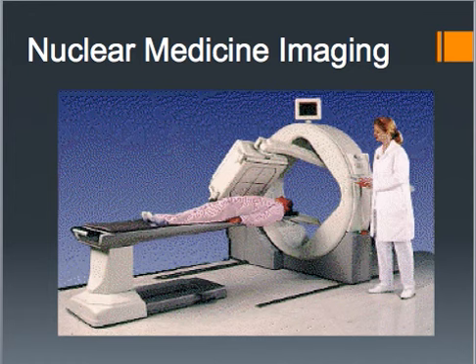So with regular X-rays, we're passing radiation through the body and using that to acquire images. With nuclear medicine, we're putting radiation into the body either through an IV, ingesting it, or inhaling it, and then the camera itself is picking up those gamma rays out of the body. So it's almost backwards. The body is emitting the radiation and the camera is picking it up instead of the camera emitting the radiation.